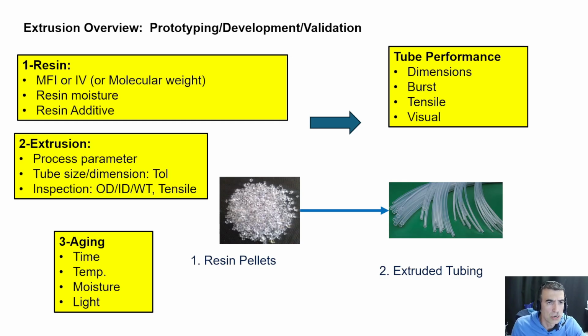In extrusion, you can also do co-extrusion, with different layers of polymers. For example, HDPE as an inner layer and PBAX as an outer layer, but you need a polymer in between, like a grafted material, that will bond the two together.